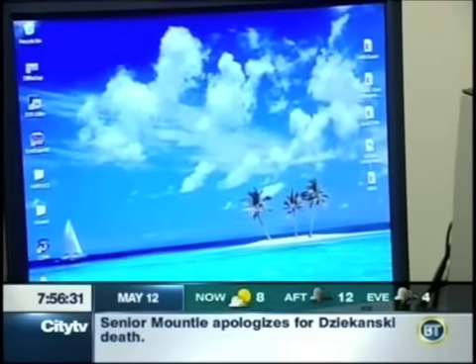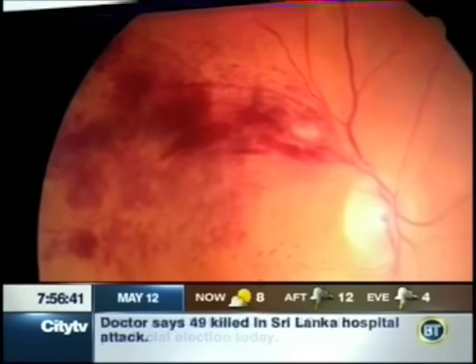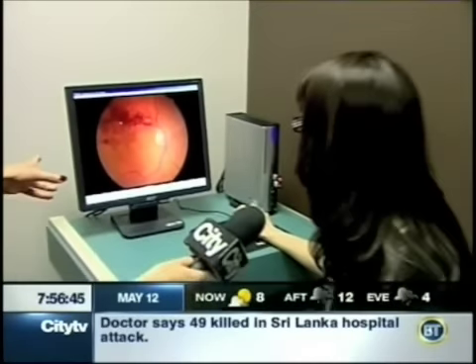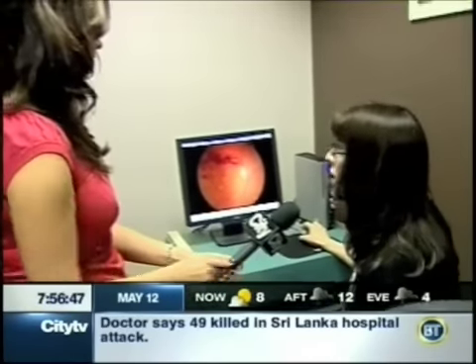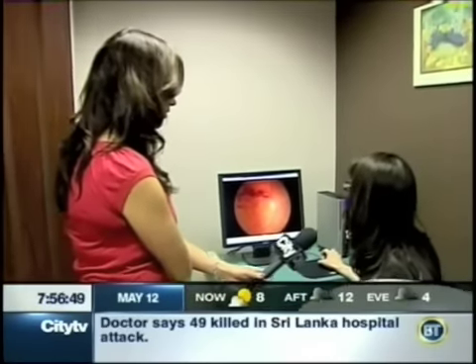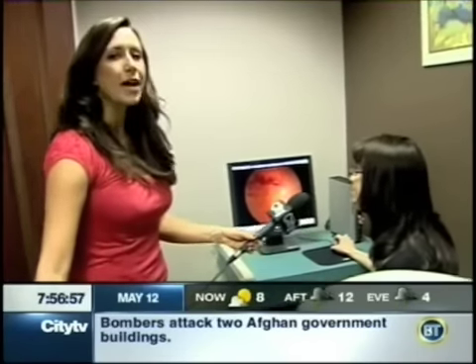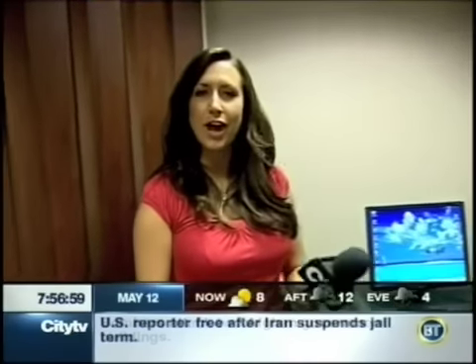Okay, and last but not least, this one is always very interesting. This is actually a spectacular broken blood vessel from a person with high blood pressure. And what would that show then? Basically, when the blood bursts there, the person can lose sight, and quite often when we check their pressure, it's very, very high pressure. And then they'll have to see their medical doctor to get that all corrected. Which is why it's important to have a regular eye exam, guys.